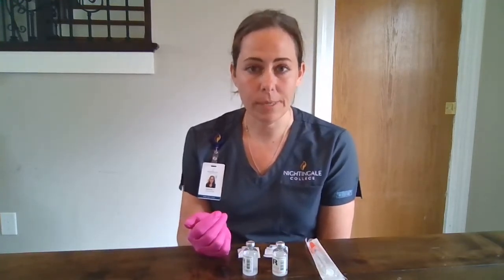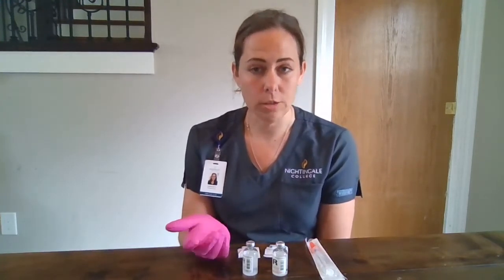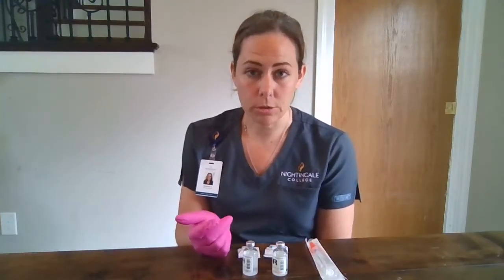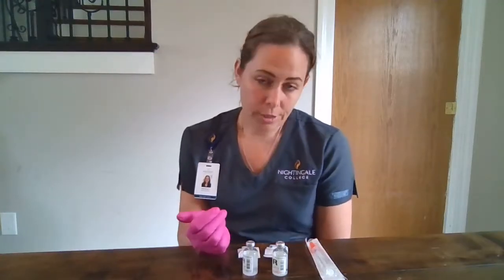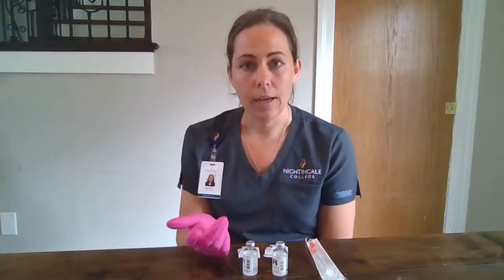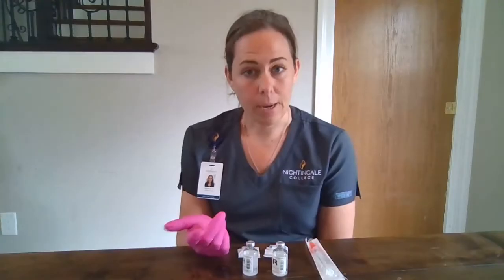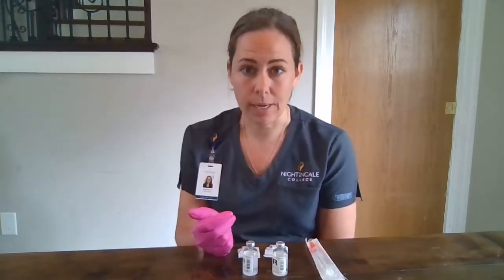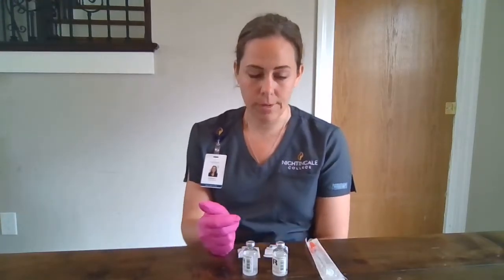Some people do complain of a little bit of burning or stinging when we administer this, so just be aware. Do you have any questions? So first we're going to start by verifying your blood glucose level. We get 110, so we'll go ahead and give that insulin, and then I'm going to bring you a breakfast tray within the next 30 minutes after we administer.